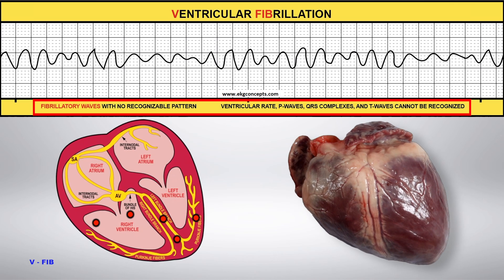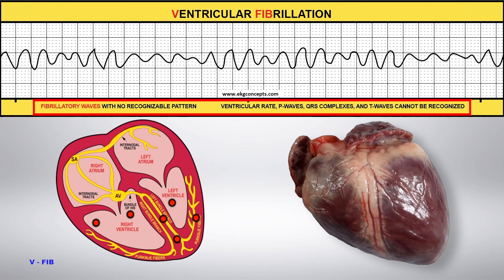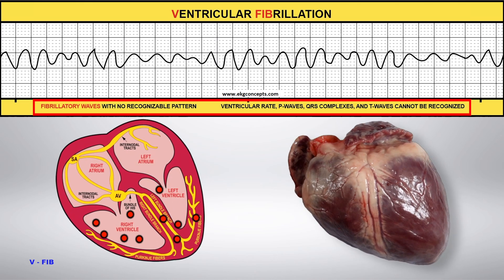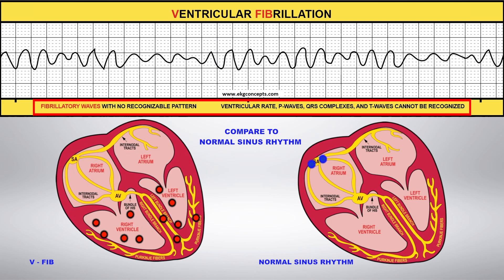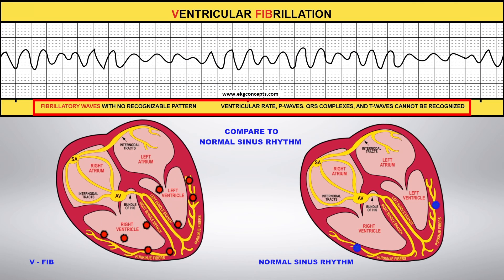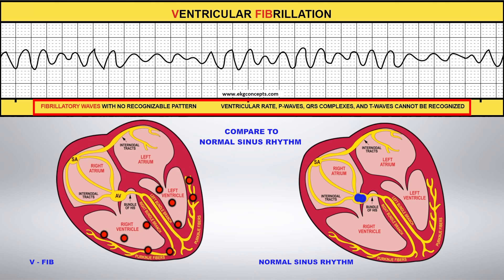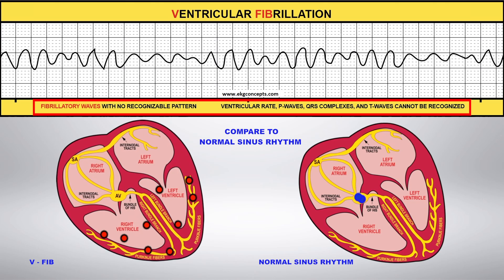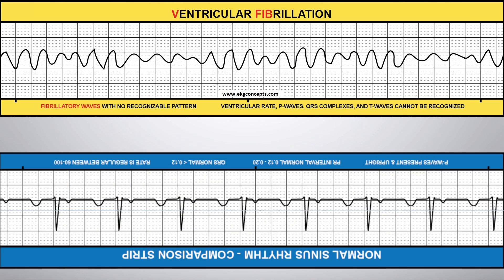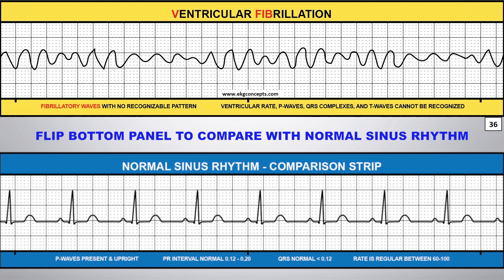This fibrillation, or quivering of the ventricles, causes the heart to stop pumping blood altogether. With V-fib, there is no pulse. Compare this to normal sinus rhythm. You can flip the comparison strip on the bottom panel to compare this rhythm to normal sinus rhythm.